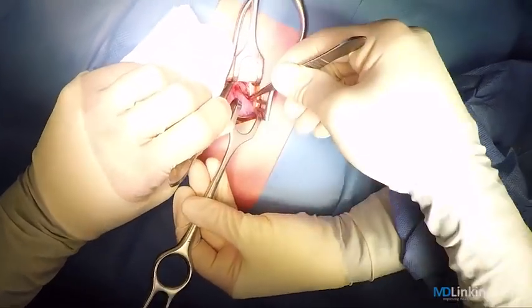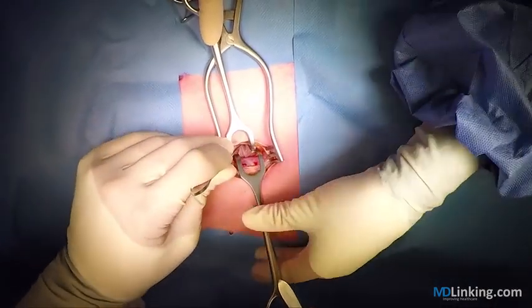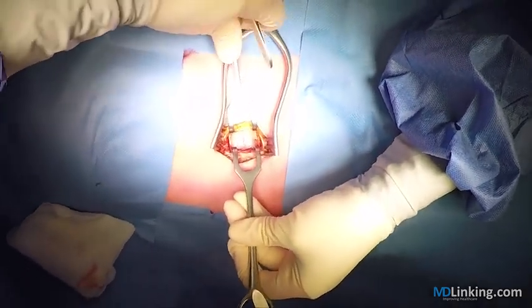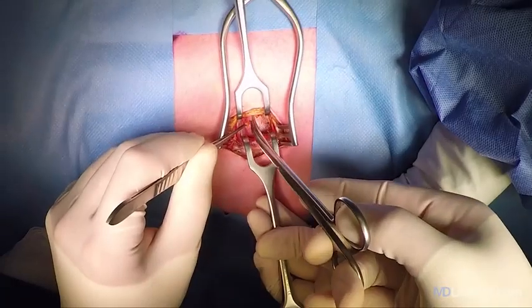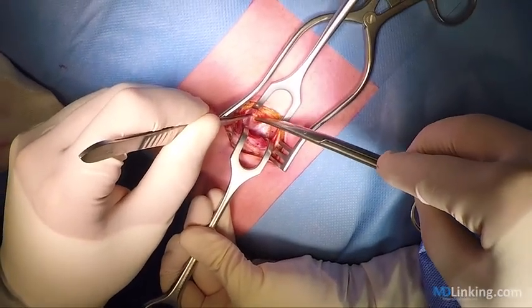So we now keep the muscle fibers aside to give a nice exposure of the peritoneum, which you can see here, and with a small cut we can open the abdominal cavity.